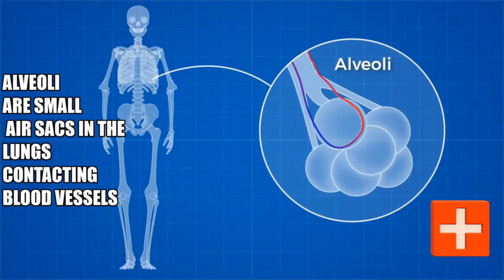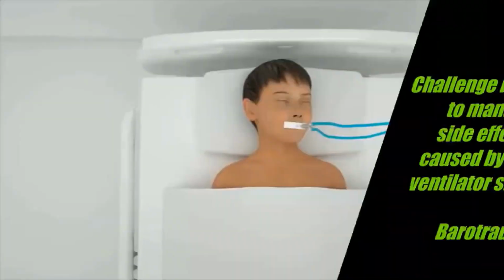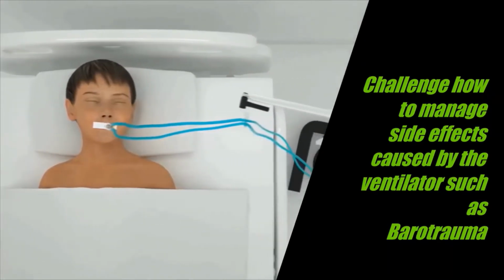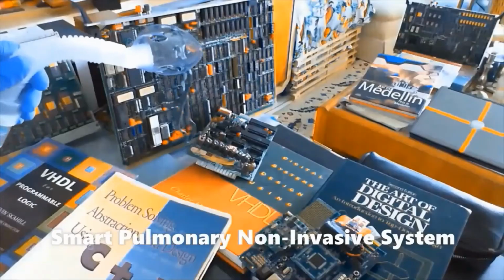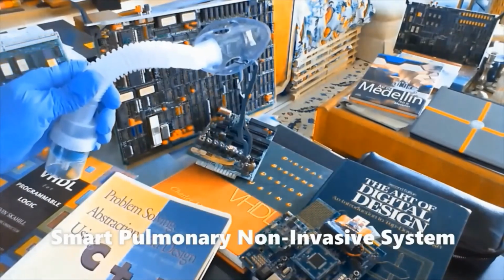The BVM is a plastic balloon or plastic bag that can be manually compressed without having to perform mouth-to-mouth resuscitation. It is an easy and simple way to force air into the lungs.